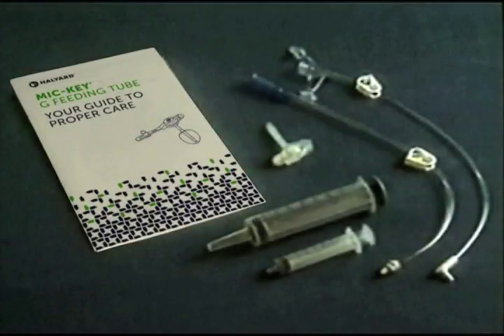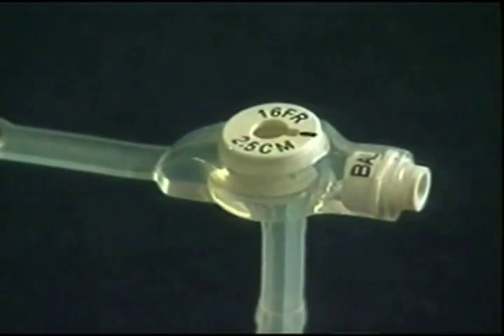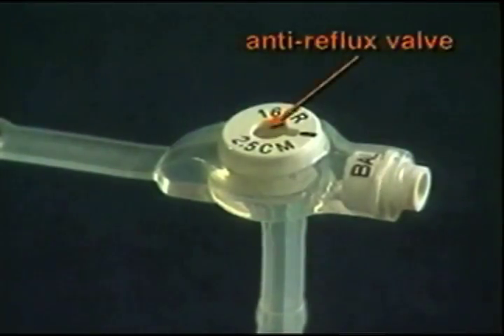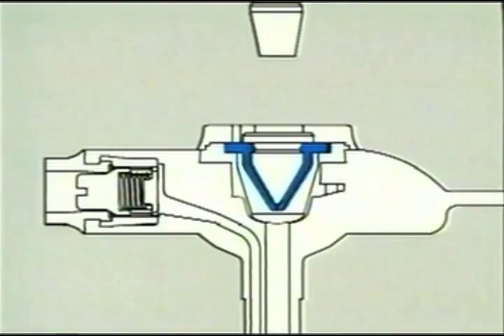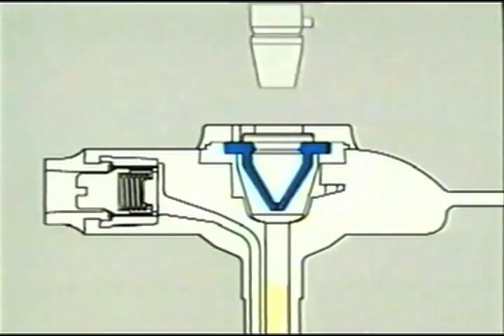To complete your tour of the Mickey feeding tube, let's look at a few more important features. This is the feeding port. This is where the extension set is connected. This is another very helpful part of the Mickey feeding tube, the anti-reflux valve. It is located inside the feeding port, where its job is to help prevent the stomach contents from leaking out when the patient is not feeding and the extension set is not hooked up.